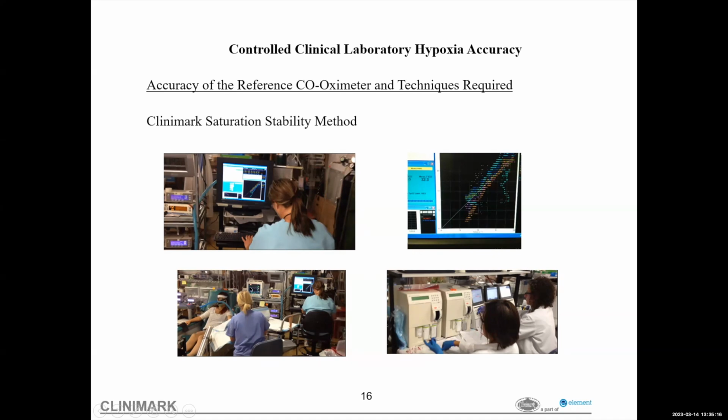And then an old picture of the hypoxia setup. You can see here we have a mask and flow-by, so it's an open system as well, and we changed the flow rate of the gases going past the subject to match, or actually overwhelm, their tidal volume. And then we plot the data in real time.